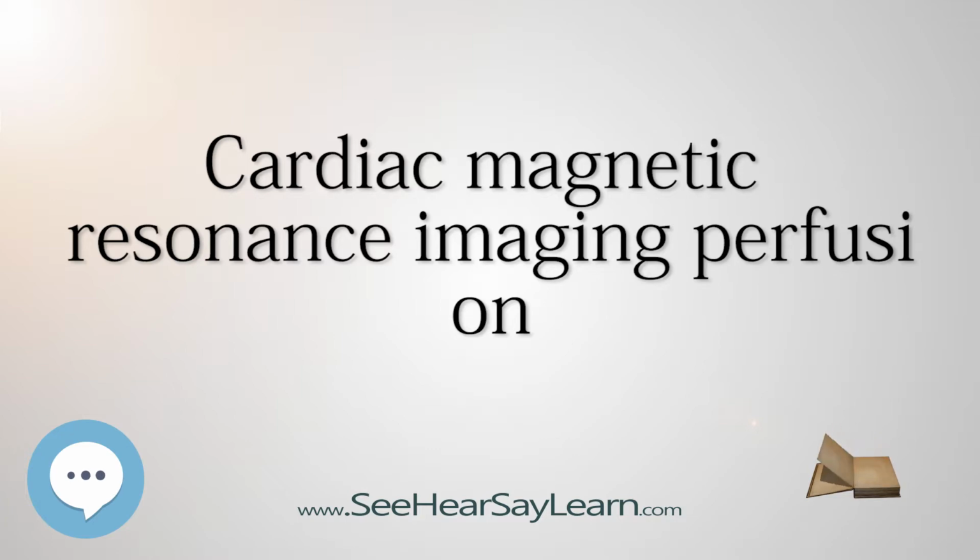Limitations. Stress CMR cannot be performed on all patients due to the relative or absolute contraindications listed below. This is a problem, especially in patients who either have a pacemaker or severe renal failure. The acquisition of the images is very sensitive to the rhythm of the heart, and scans of patients with atrial fibrillation, bigeminy, or trigeminy will sometimes be of low quality and may not be interpretable.